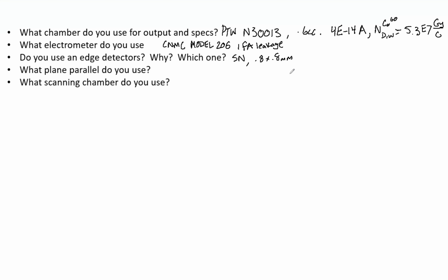It uses 100 times more signal than a micro ion chamber. So it's a lot more sensitive, and it's absolutely fantastic for really small fields, say 3 by 3 or less, or specifically cones. We use this for our cones. It's wonderful.